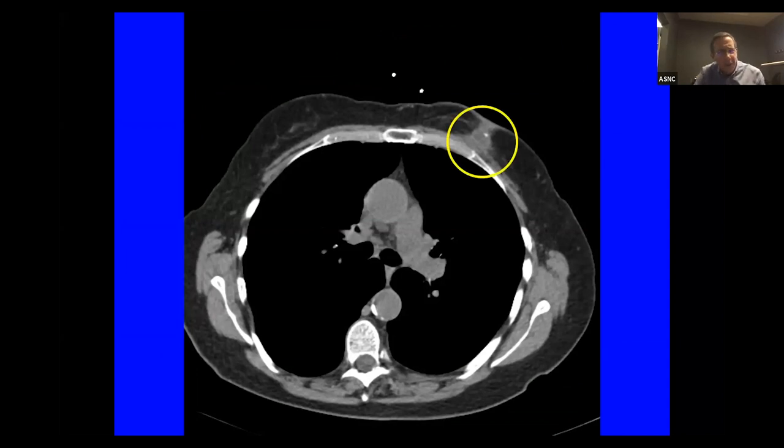This is where cardiologists start to get nervous, because we can see the cardiac diagnoses, but what about picking up breast cancer? Well, we're not really geared toward that. We now do look for the breast and the lungs, and we've accumulated enough experience that cardiologists feel like they can do a screening exam and refer these tests selectively. Some centers feel like they need a radiologist to do an overread 100% of the time. I think there's probably a need for cardiologists to have more practice in screening.